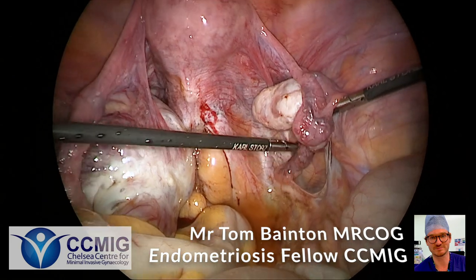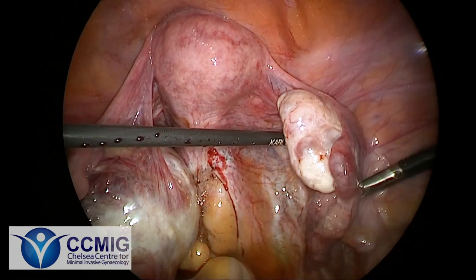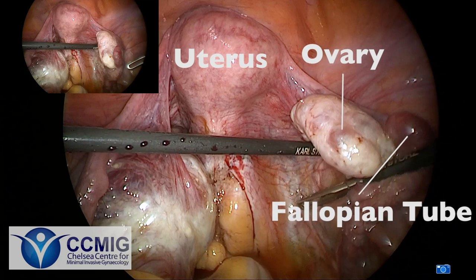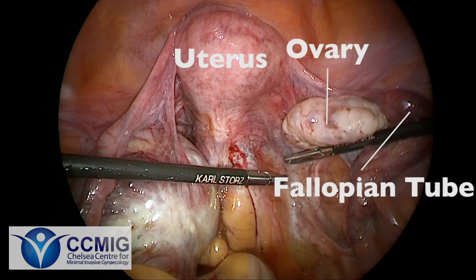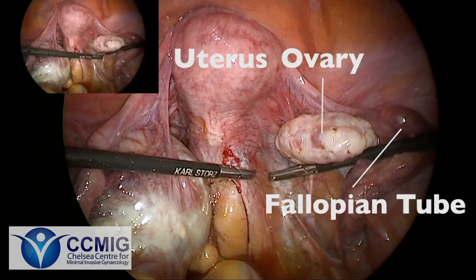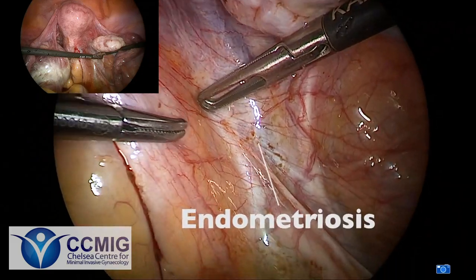We'll start with the relatively normal anatomy. Here we are looking at the right ovary, which has got a smooth, white, regular appearance, about the size of a walnut. This ovary actually doesn't seem to be significantly affected by endometriosis.